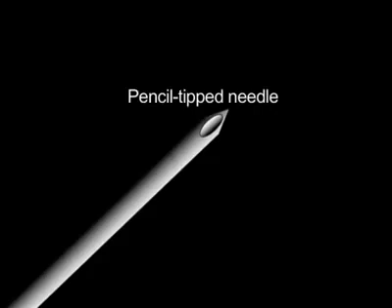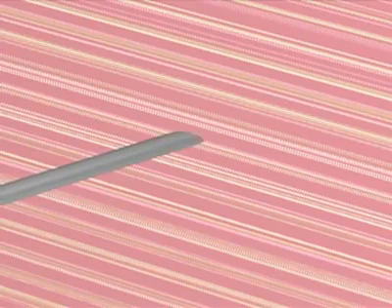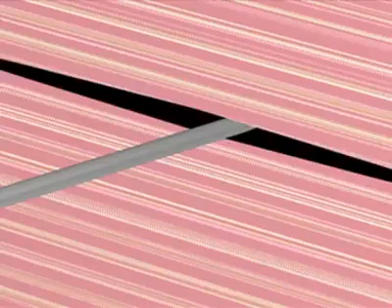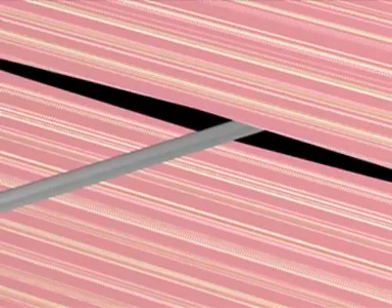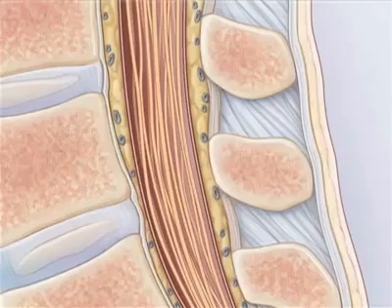Either use a pencil-tipped needle or ensure that the bevel of the needle is in the sagittal plane so as to spread rather than cut the fibers of the dural sac. These fibers run parallel to the spinal axis. The use of this needle position should theoretically decrease the leakage of cerebrospinal fluid.